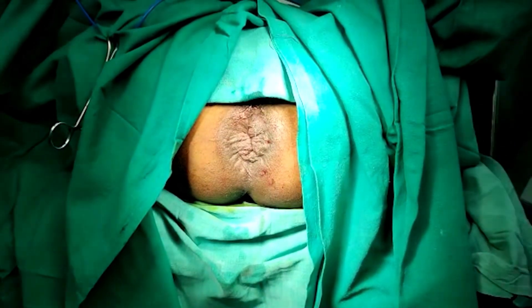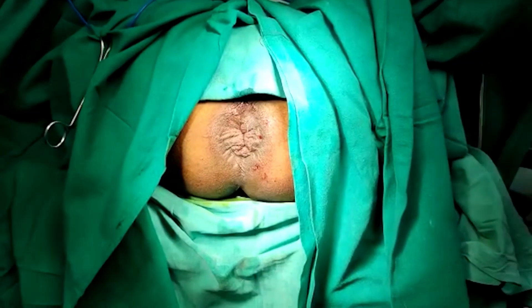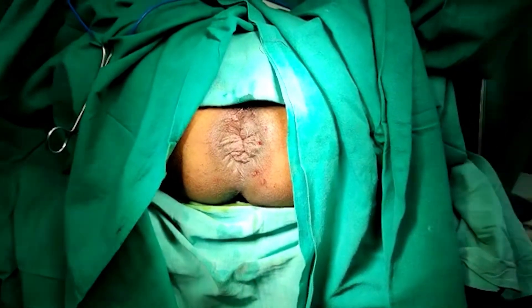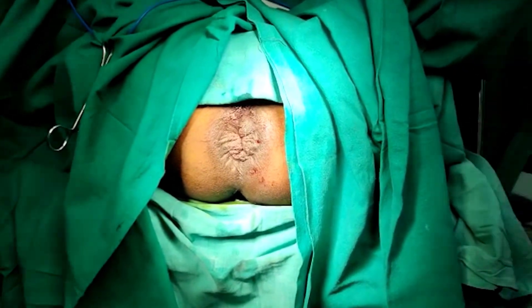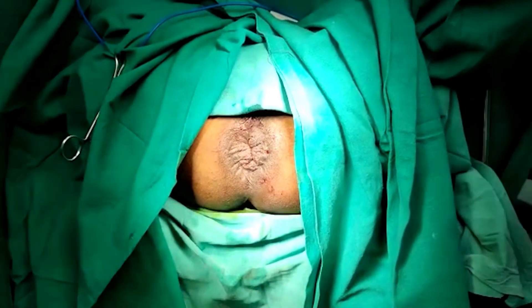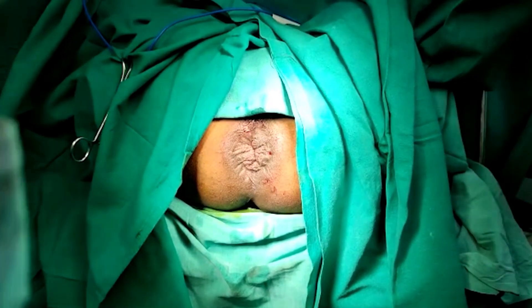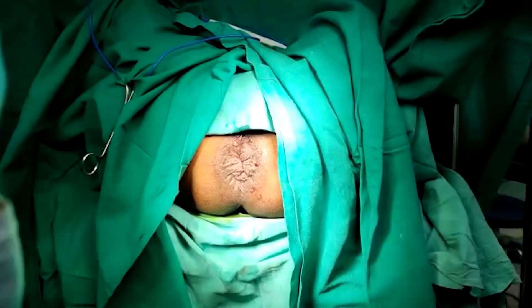This was the case of grade 4 hemorrhoids along with edematous skin tag. What I did is a stapler procedure. One can see this is just after the procedure — everything is pulled up, nothing is visible. This procedure was done in half an hour and the patient is being sent to the ward.